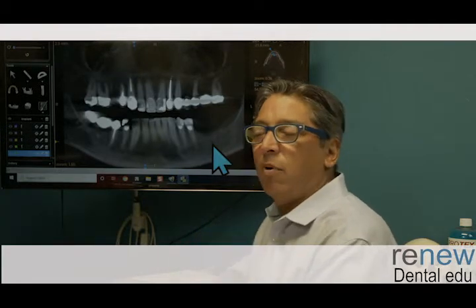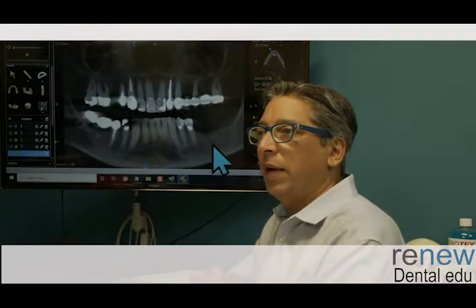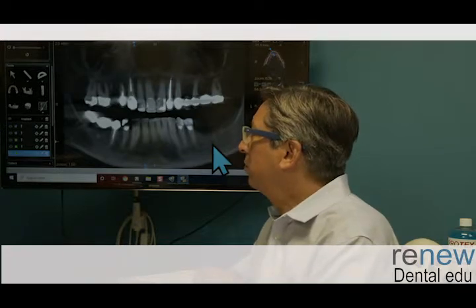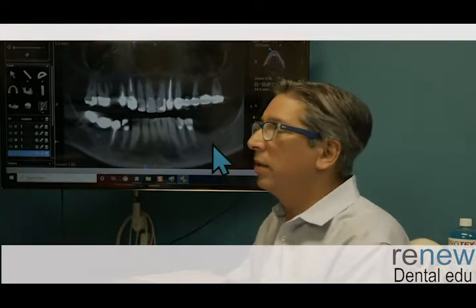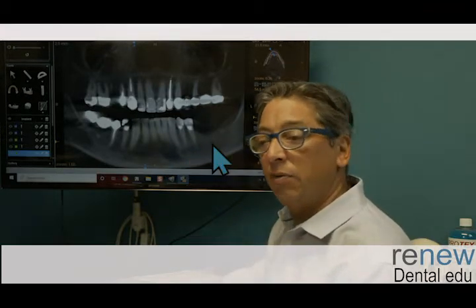This is her day one initial CT. This is probably a few years ago. We lost track of the patient, and the patient's recently back, and so we'll do follow-up cases with this case because it does provide some insights as to what is really possible and what could actually happen, and see what we could do to kind of at least get something. But this is a hopeless site, and let's look at the CT and see why. But first, let's look at our treatment assessment and see what we can get out of that first.